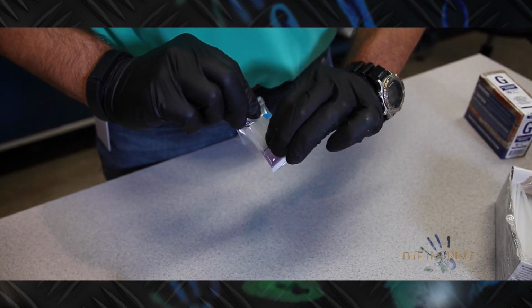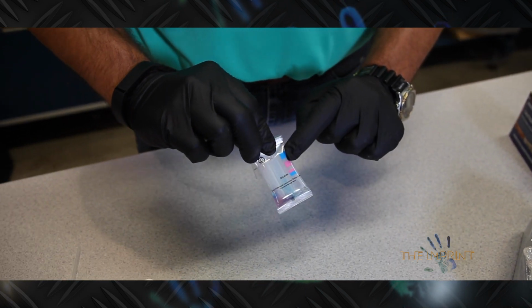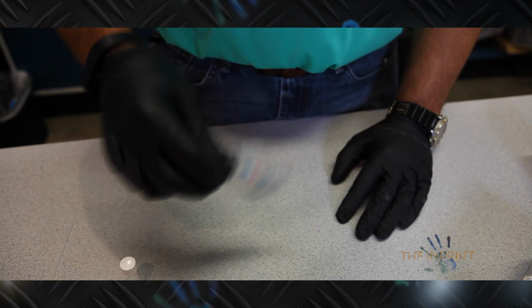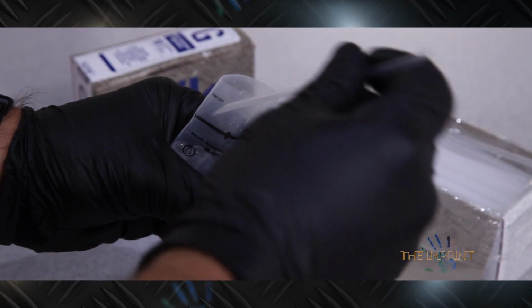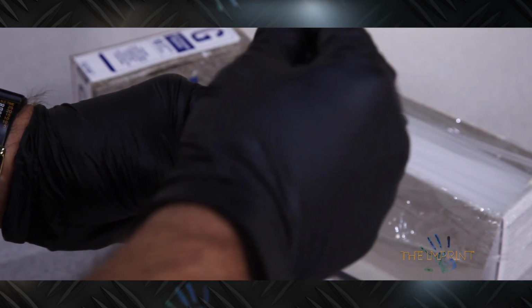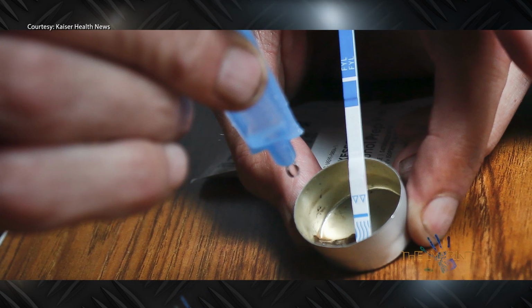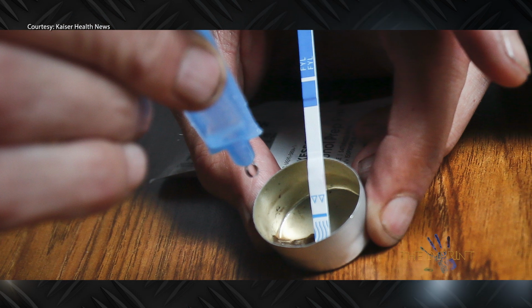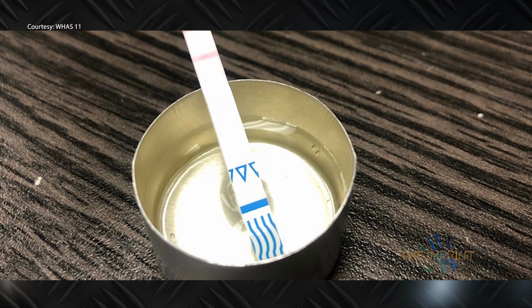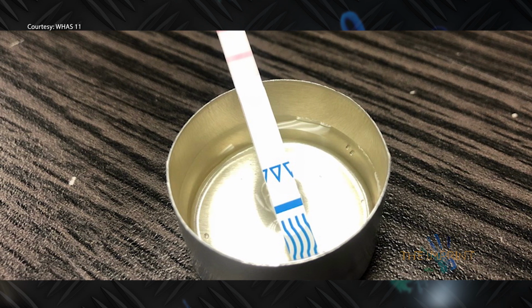One of the differences between using a fentanyl test strip versus a typical colorimetric kit like a NIK or NARK kit is that it's meant to be tested in solution, so it's a little safer. When you're running a true colorimetric test, you're taking the actual powder and putting it into the test kit. Fentanyl test strips mimic a urinalysis test, so they're meant to go in solution. So you can take a smaller quantity, get it in solution to put into the test strip, which makes it safer for the public to actually use.